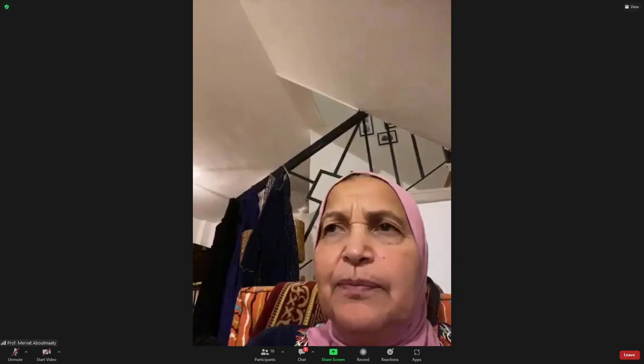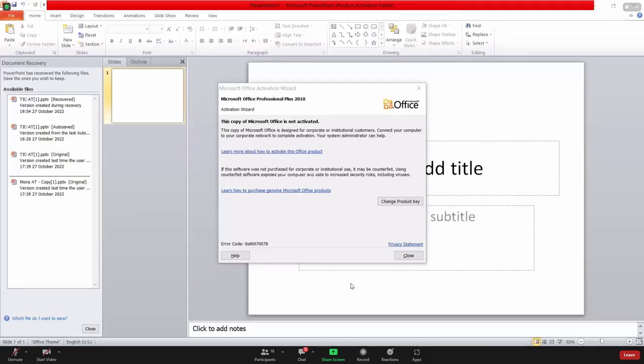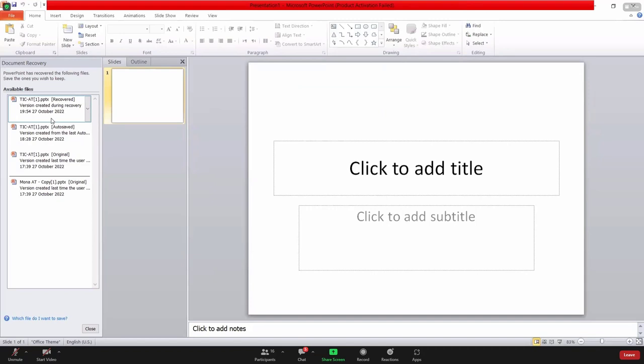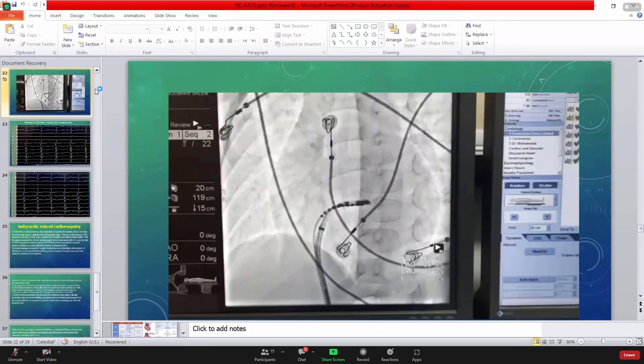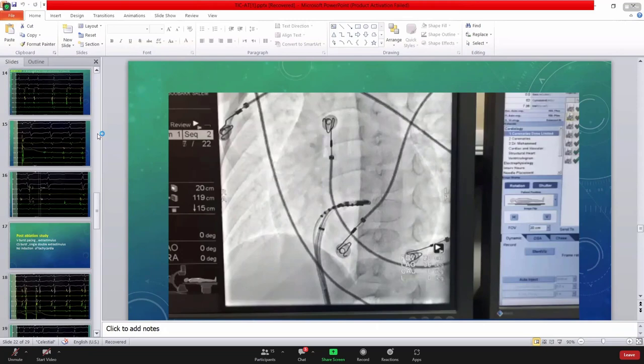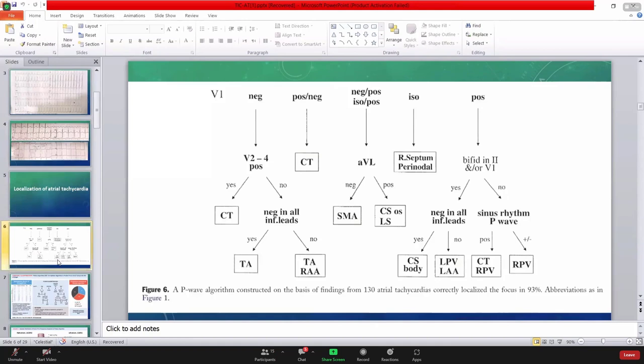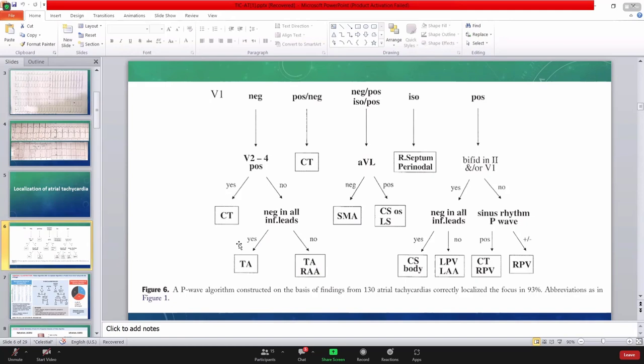The localization algorithm is simple. You have to think first - is it left side or right side? Left atrium or right atrium by the P wave in V1. If V1 is negative, this is right atrium. If V1 is positive, this is left atrium. If it is positive-negative or negative-positive, this is CS because the CS ostium is in the right side and the body is the left side. If it is flat or isoelectric, then you are looking at the septum. Then you look at the inferior leads. If they're all negative, 2, 3, AVF, so this is from below, like CS ostium or inferior pulmonary veins. If they are all positive, so maybe crista terminalis or superior pulmonary veins. It's simple.